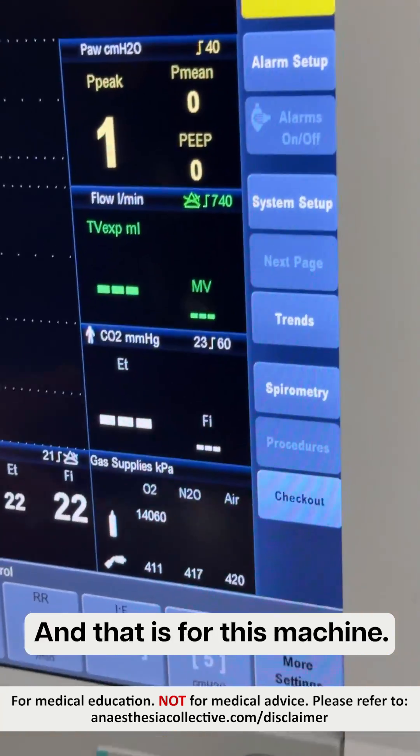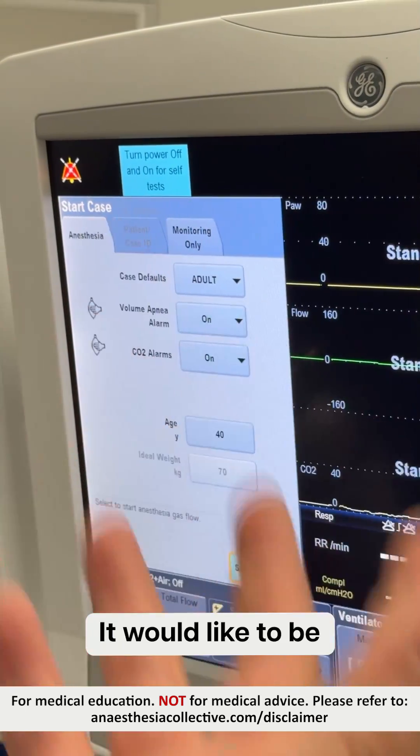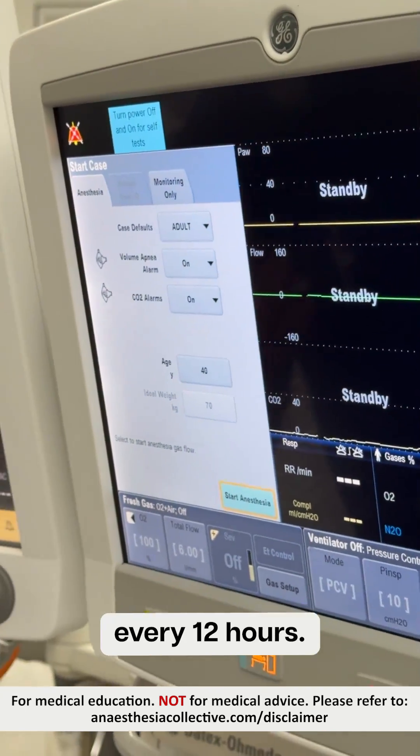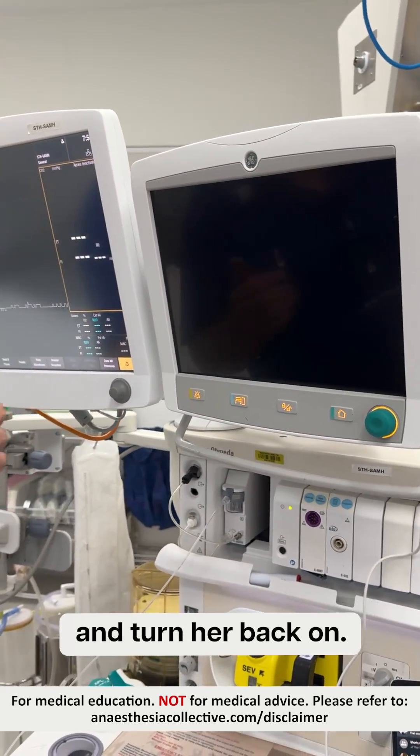And that is for this machine. Look at this sign here that's telling you to turn the machine off and on again. They like to be turned on again every 12 hours — they run their own internal checks. Just turn it off, wait 20 seconds and turn it back on. And like everything, just do all your other machine checks.